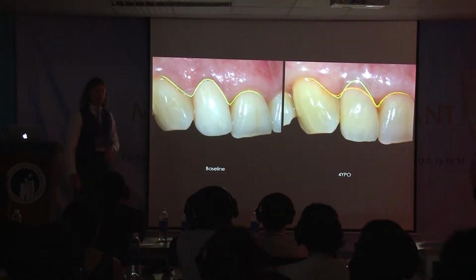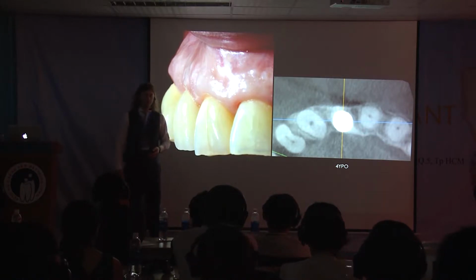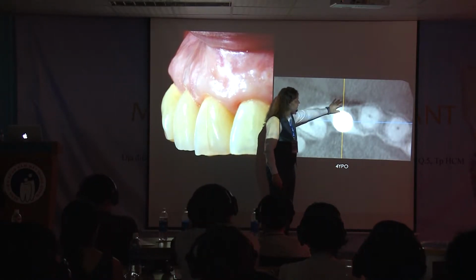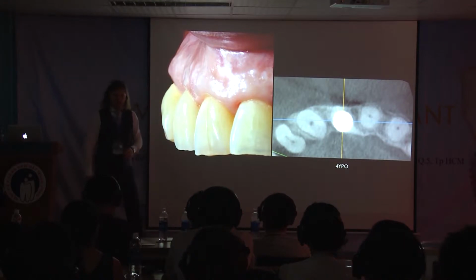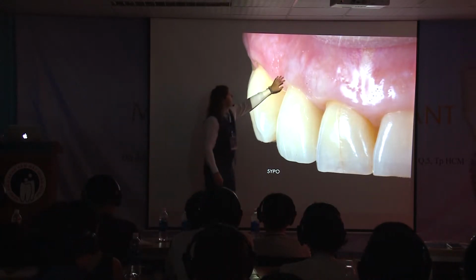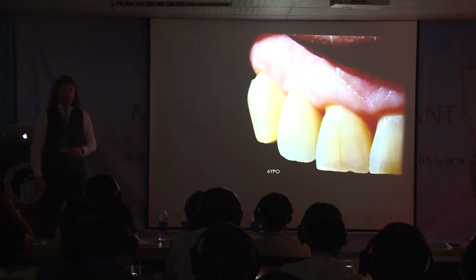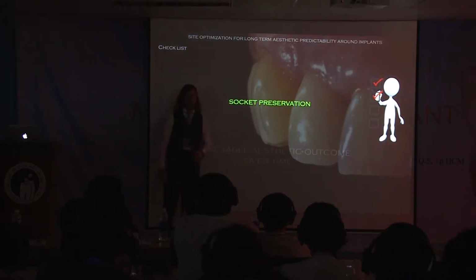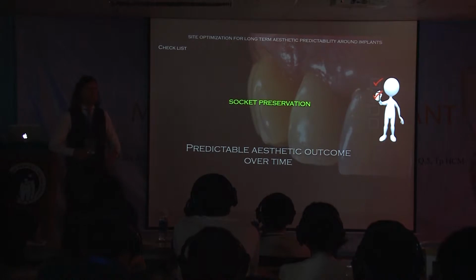After 4 years, I had the chance to make a CBCT because the patient had a problem somewhere else, and we can verify that this dimension 4 years later is approximately 1.8 millimeter. 5 years, even better. 6 years. It's very stable over time. And the bone peaks too are very stable. Perhaps the socket preservation was effective to obtain this, but I need some data, some parameters to understand why the tissue was growing.